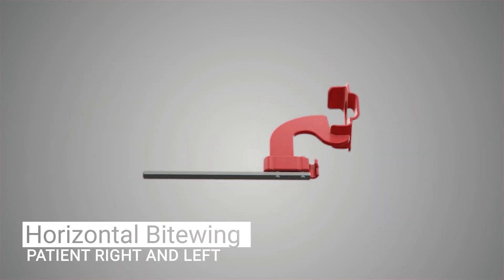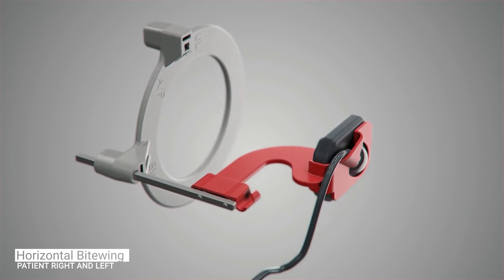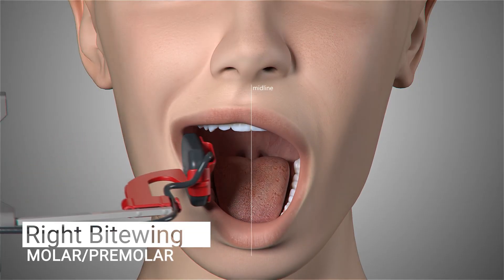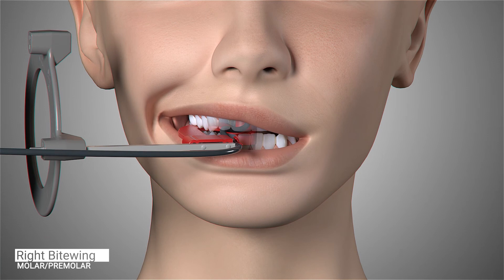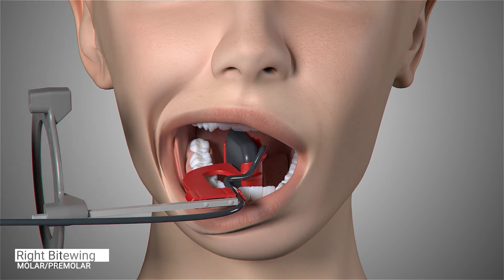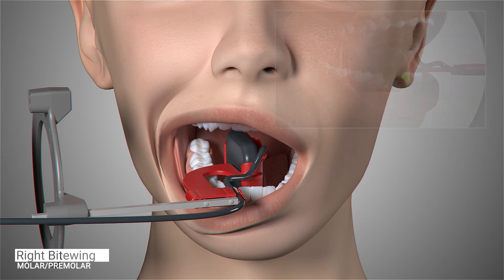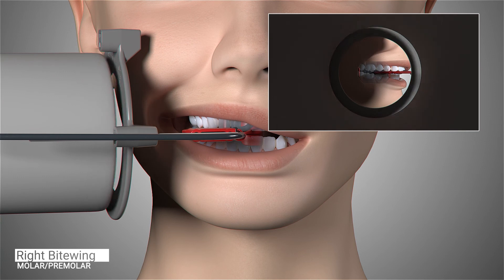The configuration of the sensor and holder will change for the next set of images in our series: the horizontal bite wing. Use the straight bite wing aiming bar and the red horizontal or vertical bite wing bite block. Position the sensor so that it is parallel to the occlusal line. Center the sensor on the second molar, move the sensor toward the palatal midline and ask the patient to close. Slide the aiming ring close to the patient's face, position the x-ray emitter cone flush with the aiming ring and trigger the exposure. Ask the patient to open slightly, slide the sensor forward and center the first and second premolar on the sensor. Move the sensor toward the midline and slightly forward again to capture the distal of the canine and ask the patient to close. Slide the aiming ring close to the patient's face, position the x-ray emitter cone flush with the aiming ring and trigger the exposure.